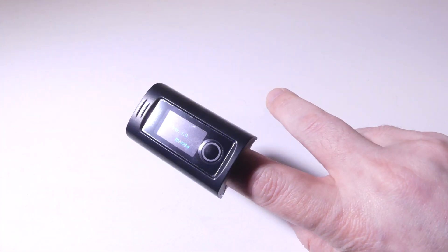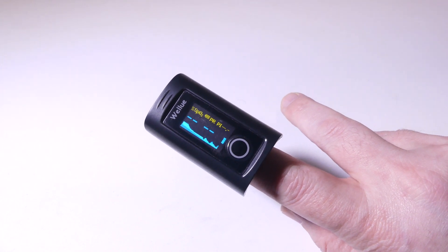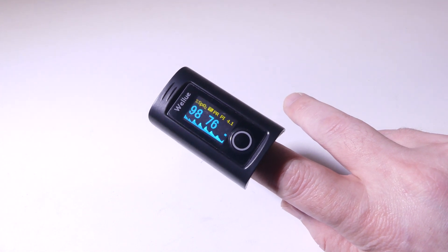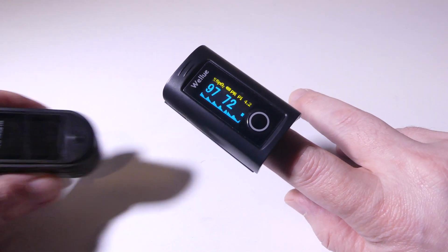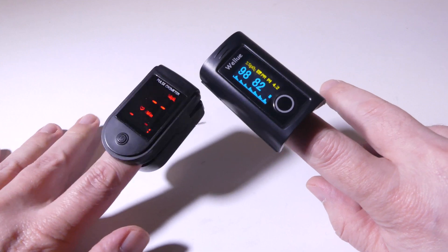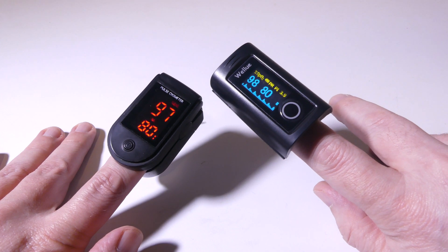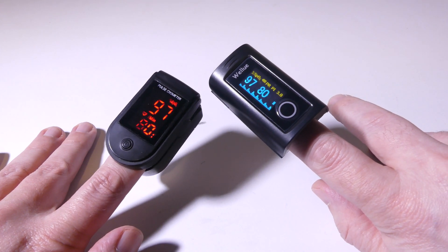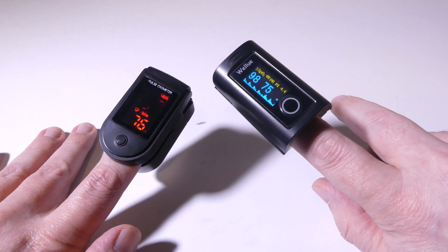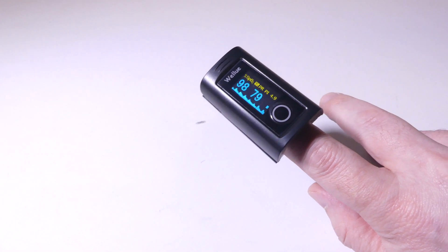Once we get my finger in here, you'll see it fire up. You get your SpO2, then your battery level, which switches back and forth from a battery level to a wireless sign. Then you have your pulse rate and your perfusion index. I have another brand here — I'm not going to name any names — but I wanted to test it next to another brand to see how close we are in accuracy. They're all pretty close within one point on either the SpO2 or the actual pulse rate, so it holds up well against competitors.